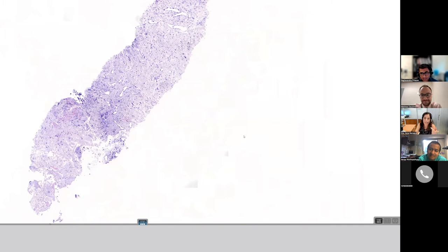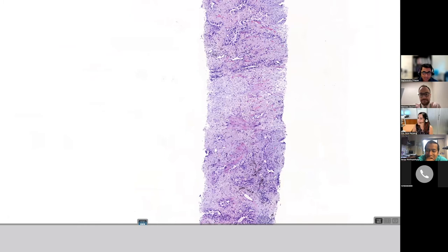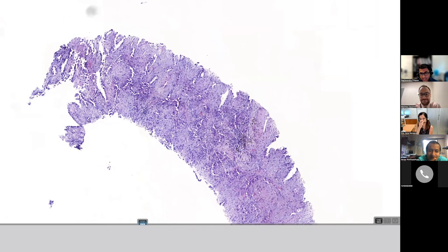I maybe would say 40, 35, something. I'm less generous than Sanjay. What do you think, Adam? I'm a little more conservative, like Irene was saying. I was exactly in the same ballpark, like 40%, 35%, because I see a lot of lymphocytes. More nuclear material would interfere with the tumor purity when you're doing the molecular testing.